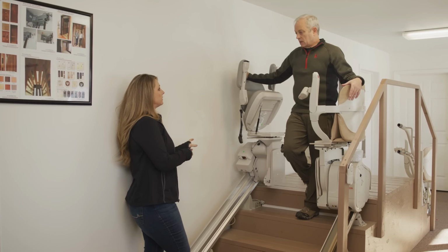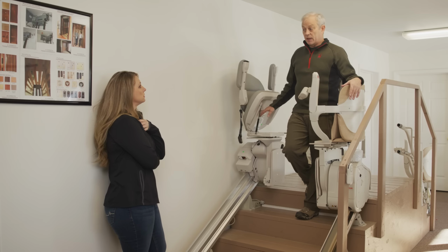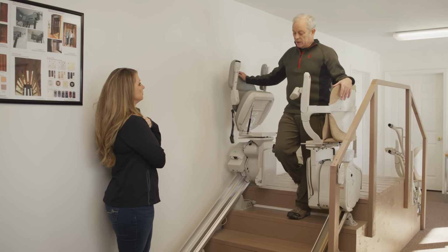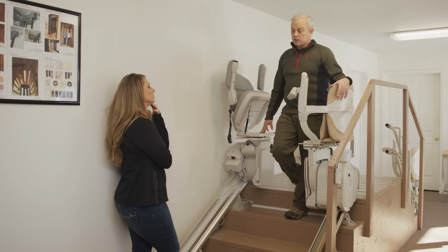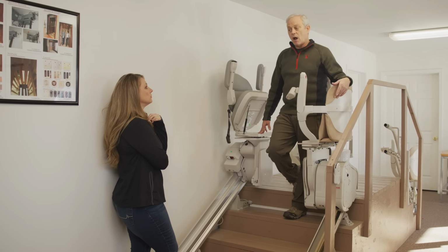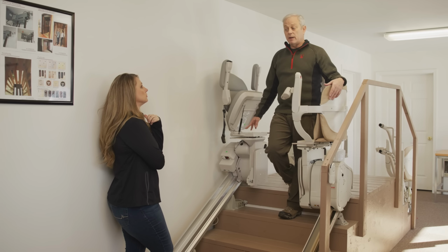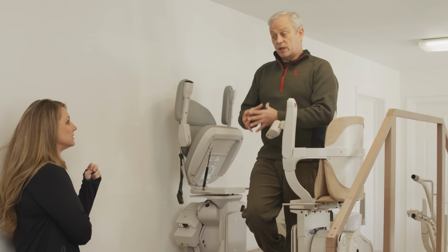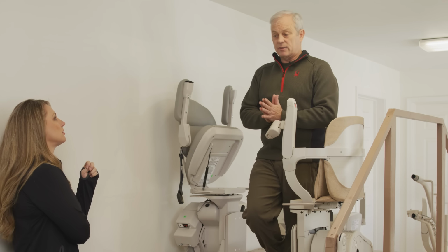Right, what does install look like? Can a family install this, or should it be installed professionally? Typically, most reputable manufacturers have a dealer network that they sell to. They don't DIY it. Part of the reason is liability, because a lot of these get inspected in certain states. Many states have inspection requirements and many do not. So you're going to have to check with your local authority as to whether or not it needs to be permitted and inspected. For instance, if you were to purchase over the internet, the problem is once it breaks, you're probably not going to find anybody locally that's willing to work on it. And that's a big issue.